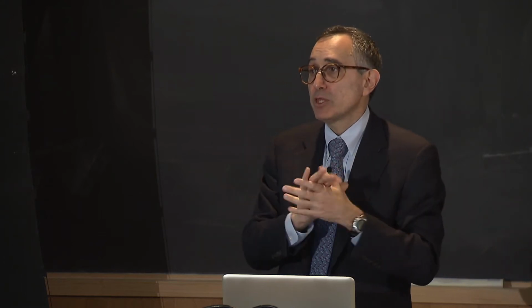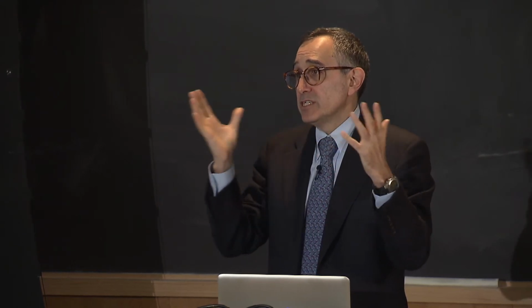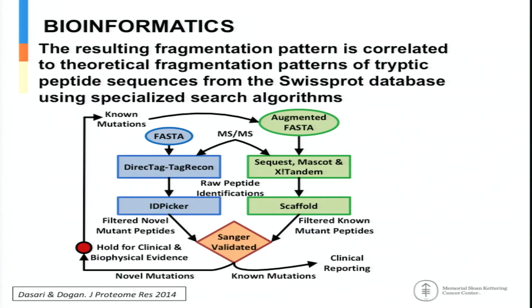And this widely applies to amyloidosis because of the variant proteins. So amyloidosis has all these mutated TTR proteins. You may not see them if they are not included in the database. You may not be able to see all the mutated immunoglobulin genes that are present in AL amyloidosis, the most common type of amyloidosis. So working with one of our bioinformaticians, we developed a sophisticated bioinformatic pipeline, in which we put all the disease-specific protein phenotypes we know for the disease into this database. So beyond what's available in the public databases, we essentially created our own database.